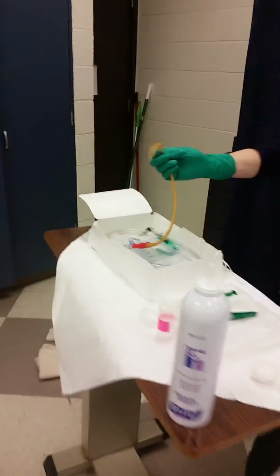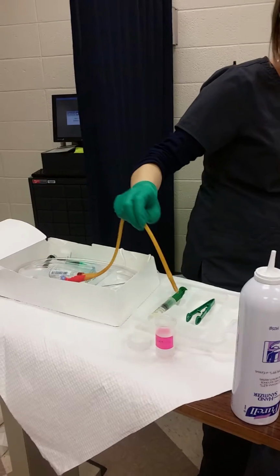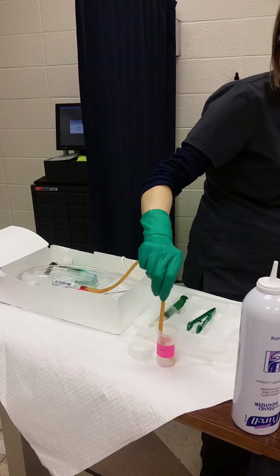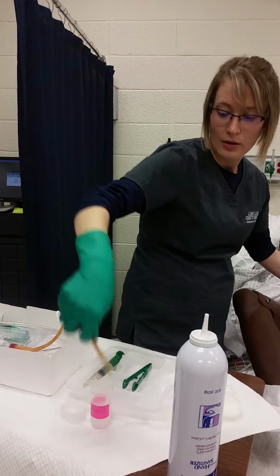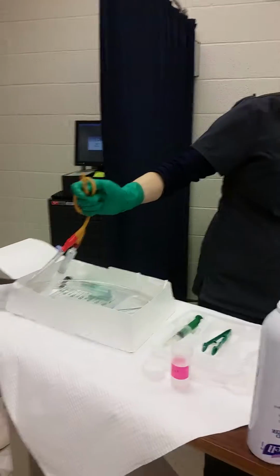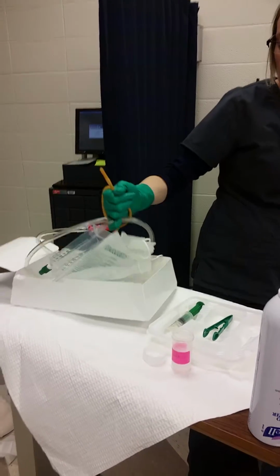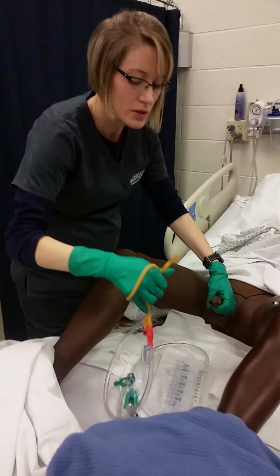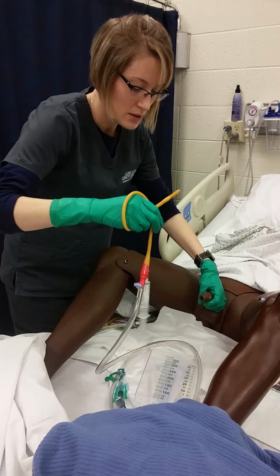the catheter tip. Take the sheath off if there is a plastic sheath on the catheter. I'm going to lubricate this up to 6 inches, which I can't fit all of that in the bottle there, but I would lubricate this up to 6 inches. I'm going to wrap this catheter around my hand and pull the entire catheter down into the bed, making sure that the catheter itself stays sterile.